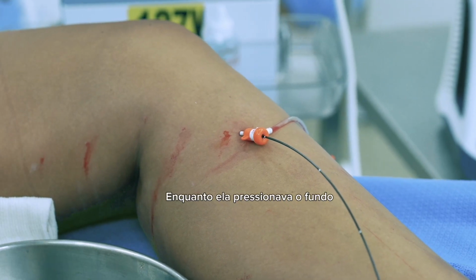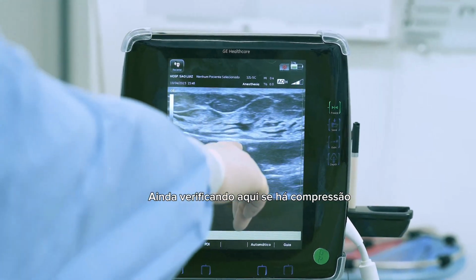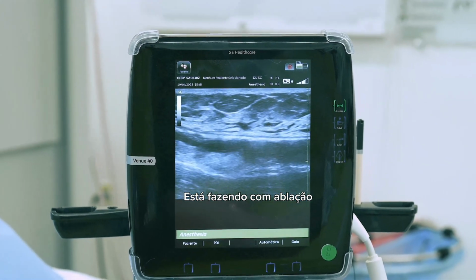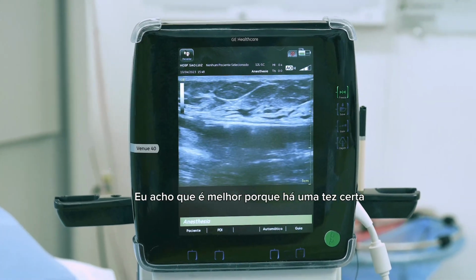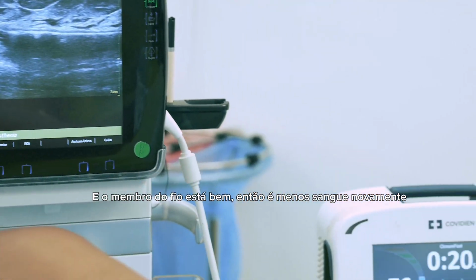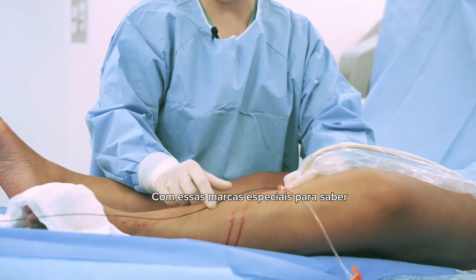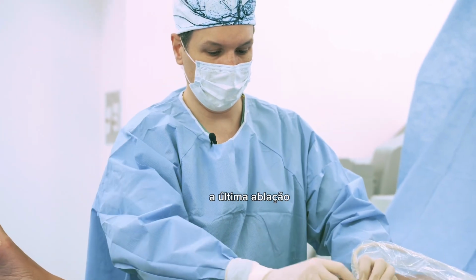While she presses the button and brings down the fiber, we keep checking here whether there is compression and the quantity of bubbles produced by the ablation. With fewer bubbles, I think it is better, because there is proper completion and the Trendelenburg is okay, so there is less blood again. At this moment, we are doing the last ablation with these special marks to know where we are. So we're going to do the last ablation.